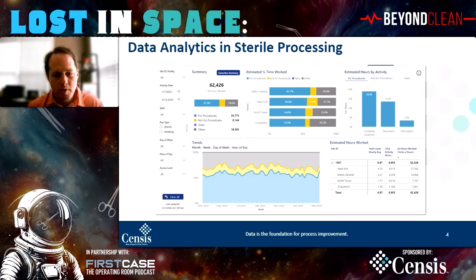If you work in sterile processing, that doesn't come as a shock. But being able to see that in the data was extremely insightful and helpful for those conversations with the OR to help them understand what was going on. So one of the things we found is that at facilities where they had been able to reduce the number of instruments and trays, or in other ways focus their productivity so they could turn more trays, they didn't get behind as often as other facilities.